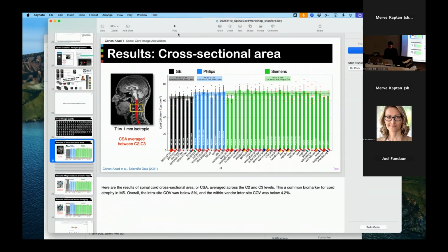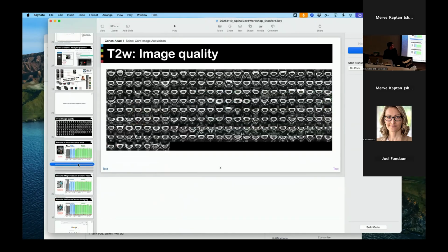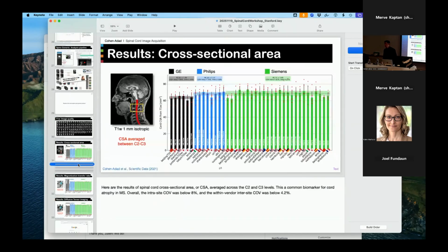Yeah, that would be my guess. And another guess would be that all the GE sites happen to have people with a smaller cross-sectional area. Yeah, I think with the GE scanner, there's a number of different filters you can apply, and if I recall correctly, they're labeled A, B, C, and D, or whatever. It doesn't really tell us what A, B, and C do, which is yeah.